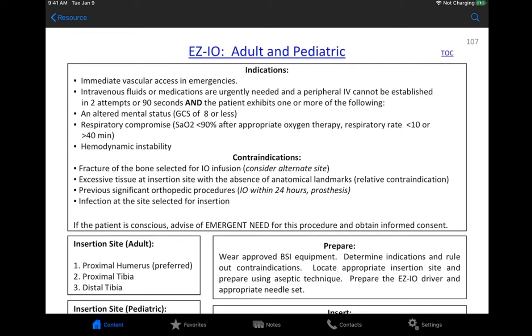Okay, but most codes probably have very poor vasculature, and I'm not a fan of digging around for IVs when I need to be slamming drugs, pushing fluids. I don't really want an IV that's going to be a positional IV or maybe a small catheter. I want something big and solid, and of course I need it fast. All right. So if you have a patient who is a code, go for an IO.